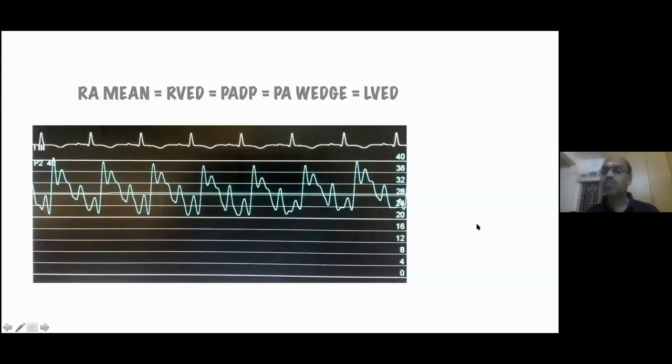But why is flow increased in the tricuspid valve during inspiration? Exactly, I mentioned the same thing. I'll go back again. In a normal person, the inspiratory fall in the intrathoracic pressure also makes a fall in the intracardiac pressure, so the RA pressure falls. But the flow increases. The reason the flow increases is augmented systemic venous return, increasing the RV cardiac output.